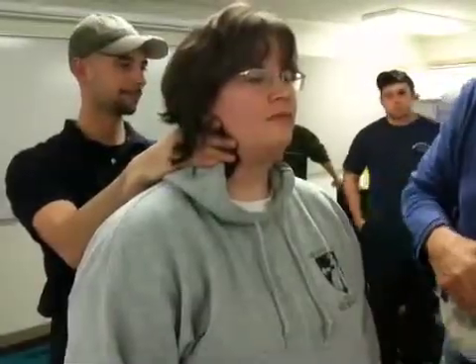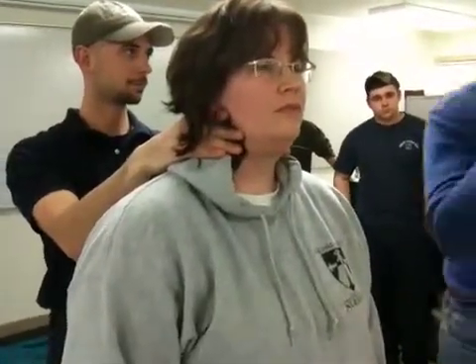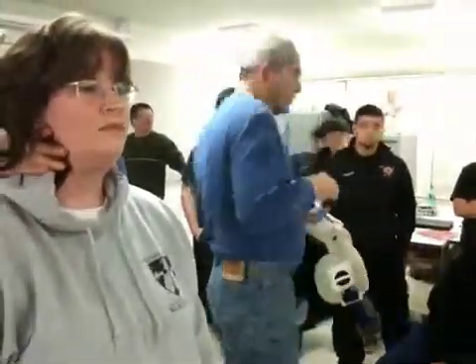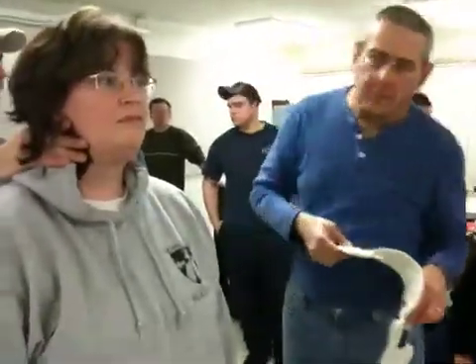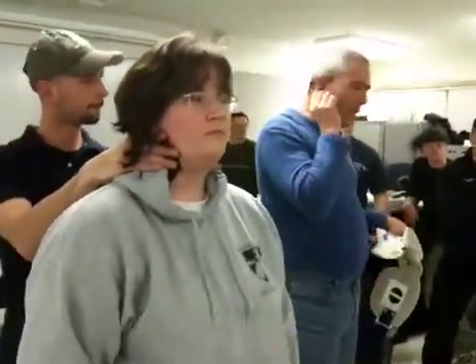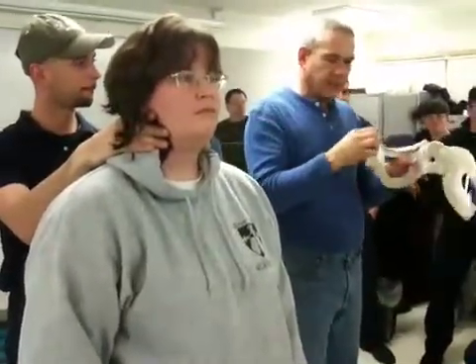All right. So now I'm going to put on the cervical collar. There are a couple of ways to do that. Pull your hair back a minute. Your earrings aren't too long. Yours are good. Where are my other two? We're missing somebody. Dangling earrings, for females or males, are a problem because of where these things rest.